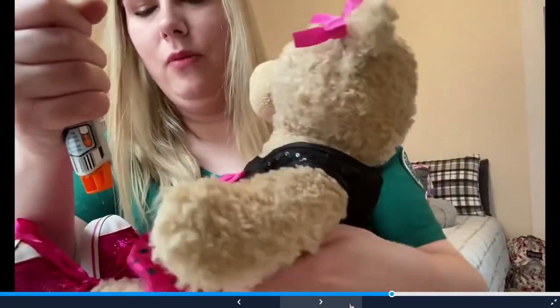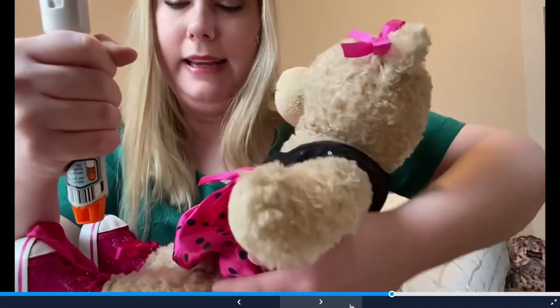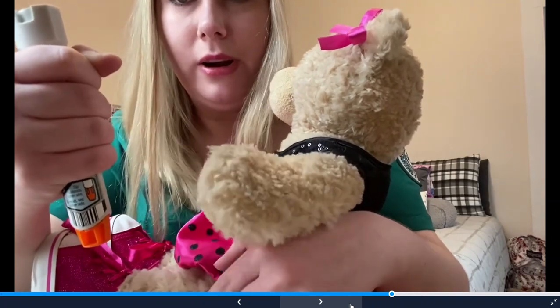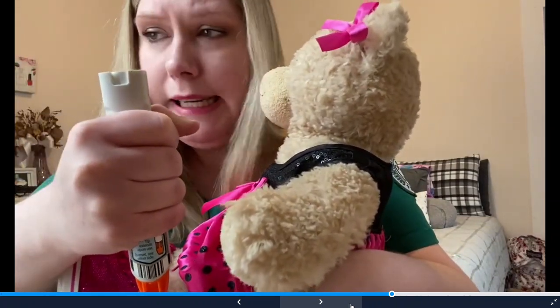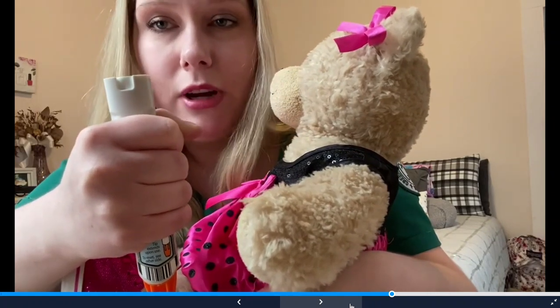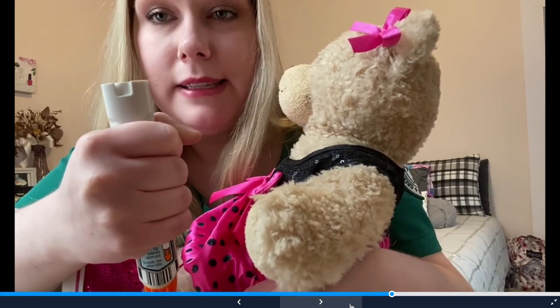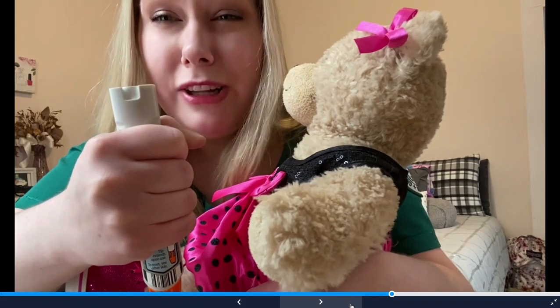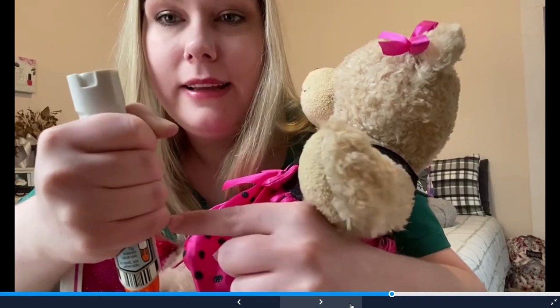All right, while you're holding your friend still, you're going to locate where her outer thigh is, and that's where you're going to put the needle part inside. So now you might be wondering, why do we have to use a needle instead of medicine? Remember, we talked about this when we were talking about epinephrine and Benadryl. Sometimes there are certain medicines and situations where you need one that works really, really fast, like speed lightning, which happens to be in needles.